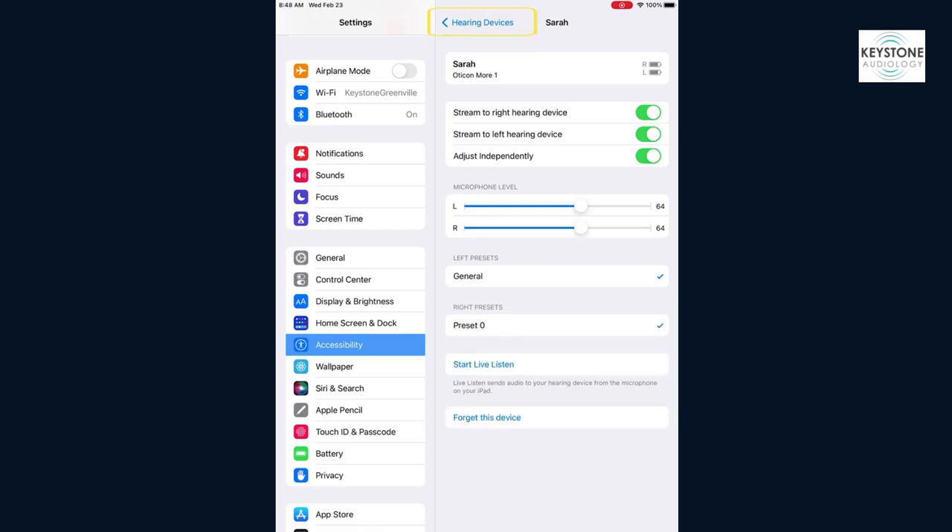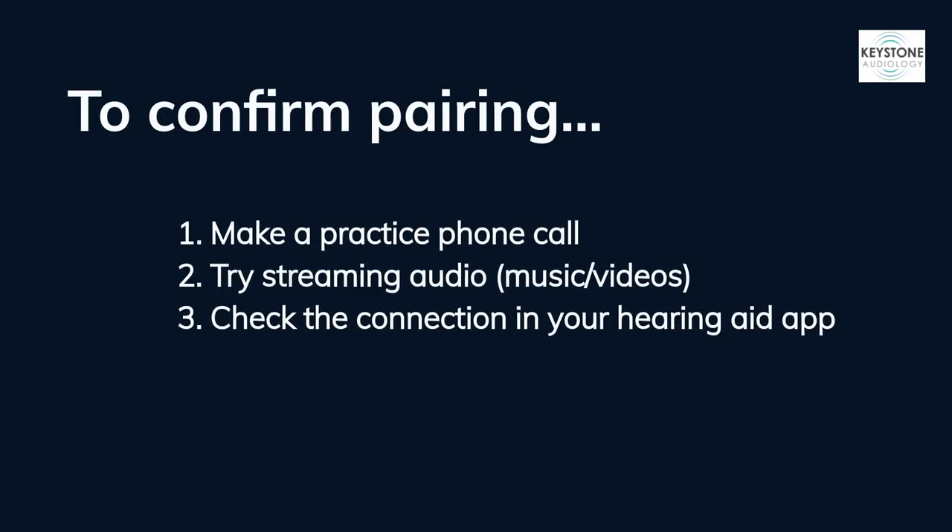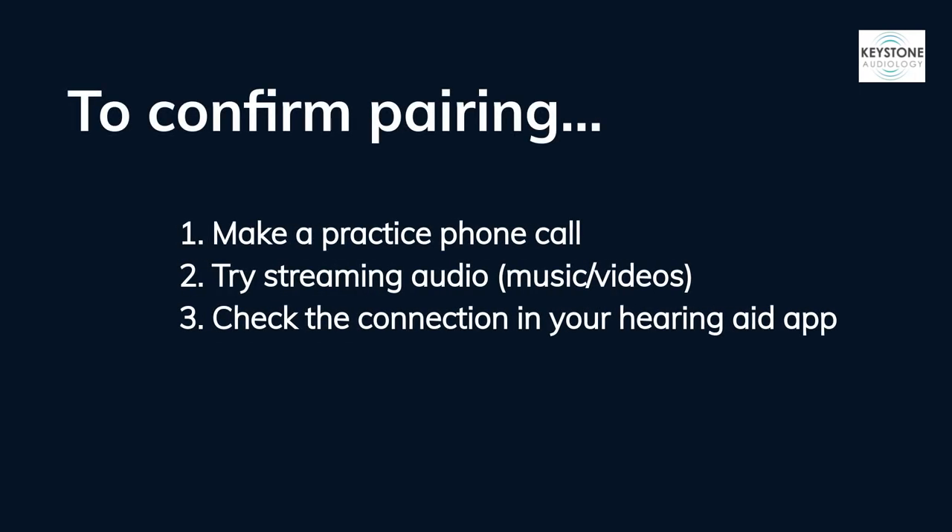Click the Hearing Devices arrow at the top of the screen to go back. Now you should see your name and that your hearing devices are connected in blue. At this point, you will have successfully unpaired and re-paired your hearing aids to your iPhone. To confirm the pairing, try making a practice phone call or streaming audio from your phone.